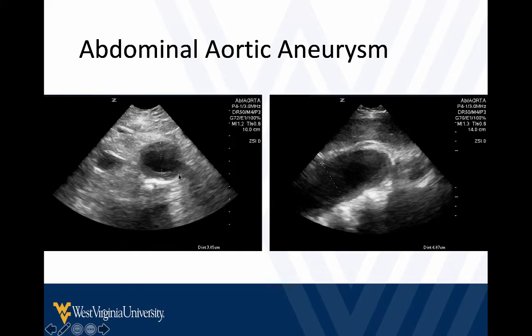Here we see the spine with shadowing, and here's the abdominal aortic aneurysm. Notice we see some thrombus within here, but when we measure, we measure all the way out to the walls past the thrombus — we don't measure inside where the thrombus is. And here's just a longitudinal view. We see the spine behind it. These are abdominal aortic aneurysms.